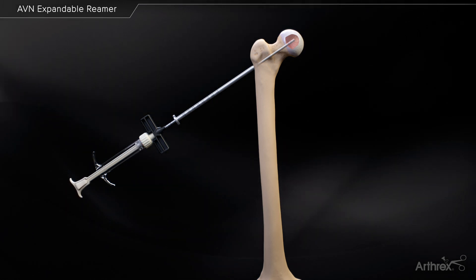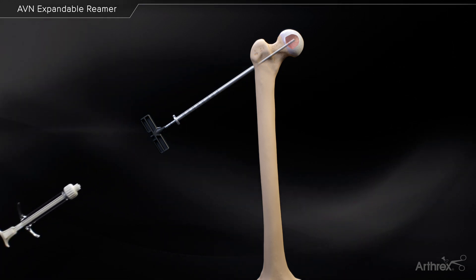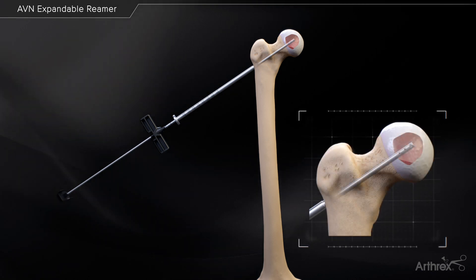Slowly inject the material until the syringe is empty. In order to fill the void created by the expandable reamer, use the inner stylet to expel the DBM mixture from the delivery cannula.